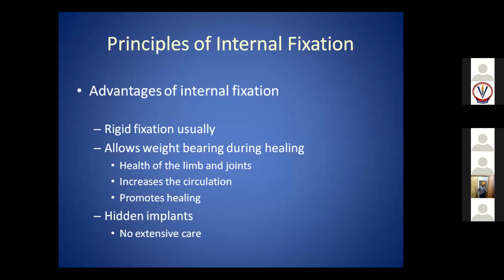During the process of healing over the 8 weeks, the implant should not be disturbed, the fracture site should not be disturbed, but the animal should walk. That is the criteria for an orthopedic. Okay, health of the limb and joints, increase the circulation, it should promote the healing, and it should not need extensive care, because as I said, with our veterinary orthopedic patients it is not possible to provide such care as for a human orthopedic patient. So the technique you have used should not require extensive post-operative care.